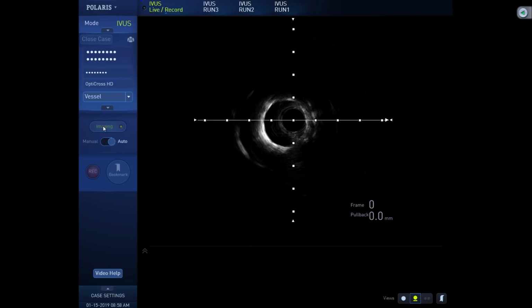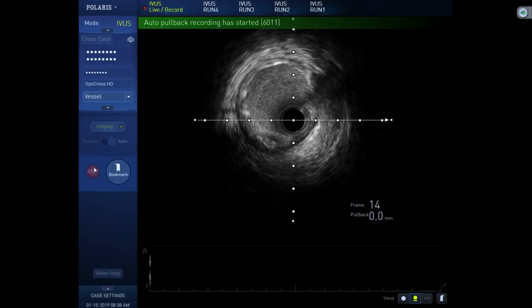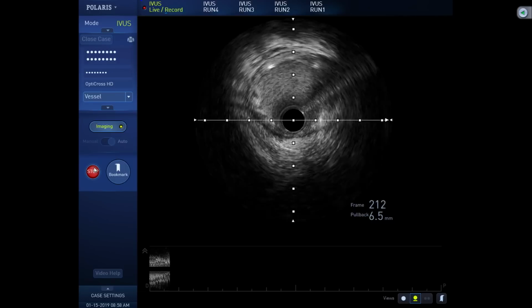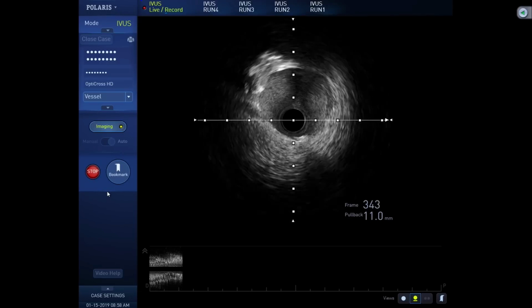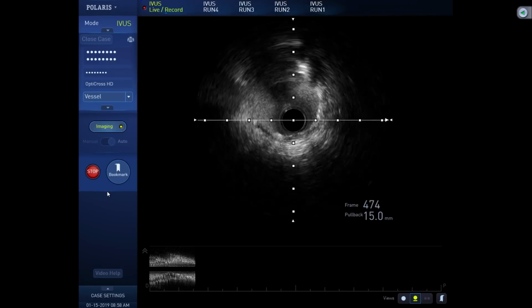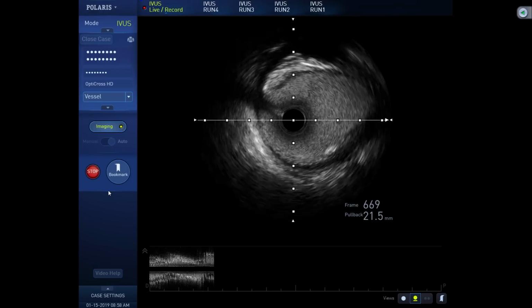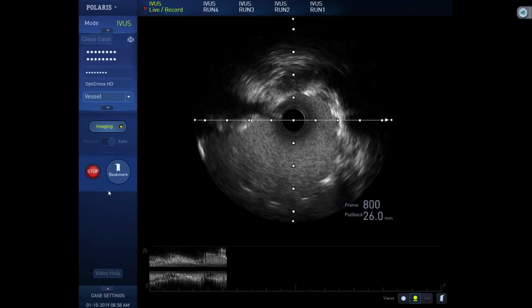Okay, start. This is a mid LAD stent. Looks good, nicely apposed. I think it could be expanded a little further? No, it looks very good right now. I know we are so used to OCT. Let's see the area in between now. The stent edges come back, nice, good. This is the in-between area. Looks good. No dissection. A little bit? I thought there was a little intimal flap. That is part of PTCA. We'll remove it.